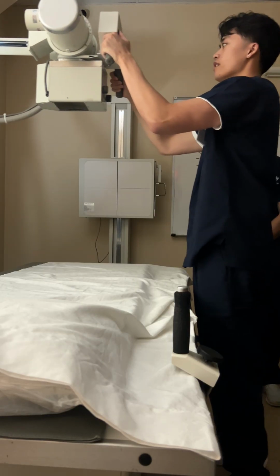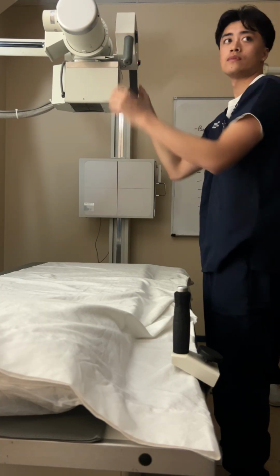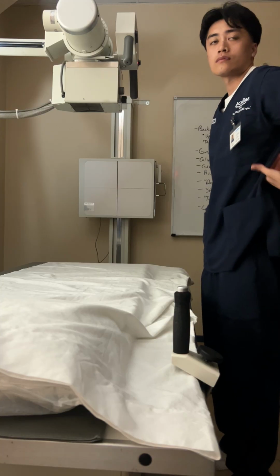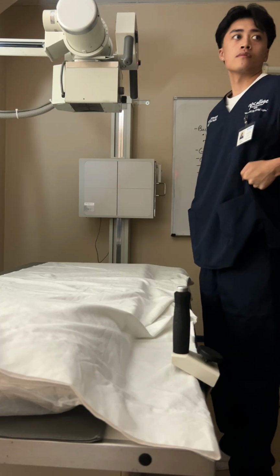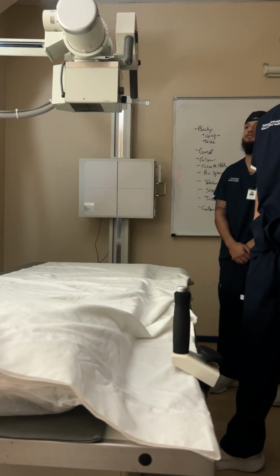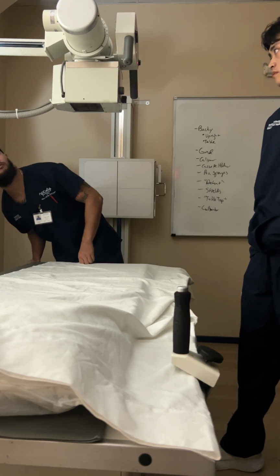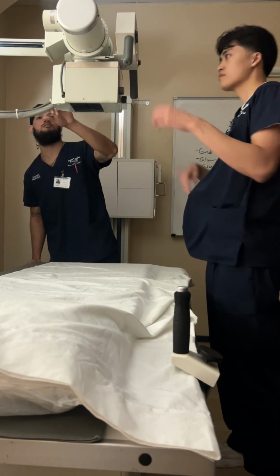And real quick, guys, another important thing that we need to know. When you walk into your x-ray room, you always want to have an idea of which side of your x-ray tube is the anode and the cathode. Most of the time, the rooms are already set up with that in mind. But for now, since we're getting used to looking at all of this, see if you can identify where on the x-ray tube the anode and the cathode are, okay?